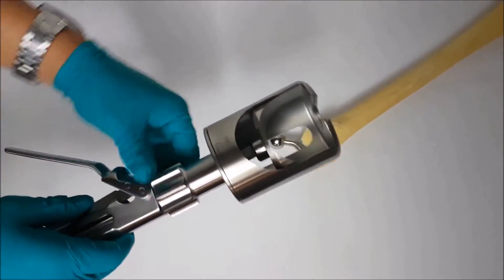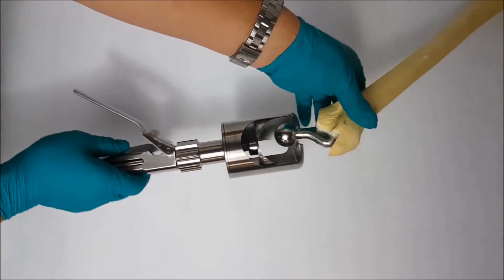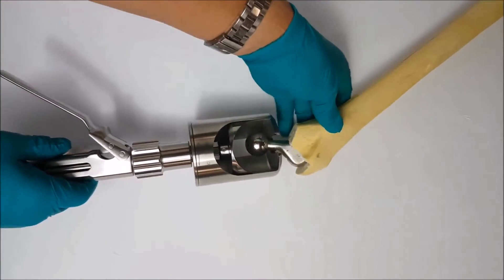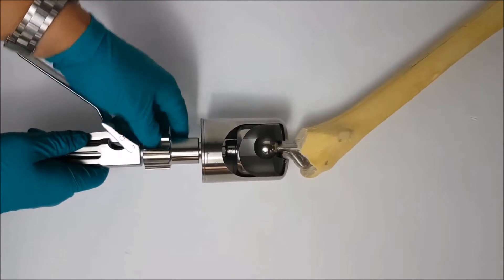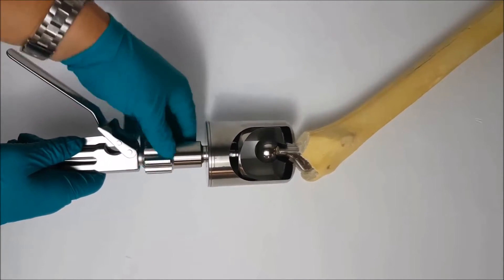Place the instrument over the femoral head as such. Turn the adjustment knob to the left, separating the ball retainer sleeve from the head disassembly cap.